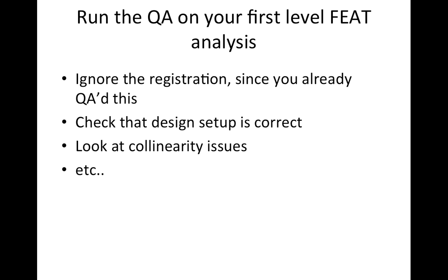Check that your design matrices all look good — there are as many stimuli as you thought there should be, look at your collinearity, hopefully you don't have any — and just all the usual things that you do to QA a level one FEAT analysis. I have a whole other video on that which you can check out in the FSL pipeline tutorial.